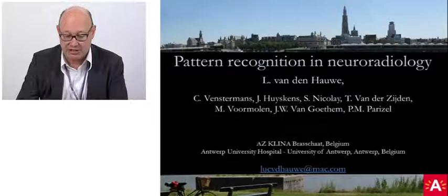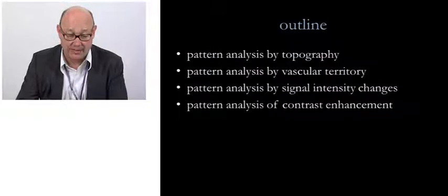So, pattern recognition in neuroradiology. Actually, this is the outline of my presentation. We will do pattern analysis based on topography, on vascular territories, on signal intensity changes on MR, and on the pattern analysis of contrast enhancement.